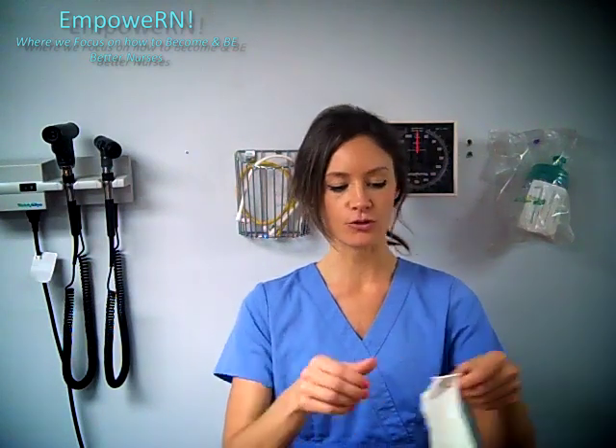What we need to do first is wash our hands and apply gloves. Now this is a cleaning procedure — it's not sterile. So we can just use the regular gloves that are in the rooms.